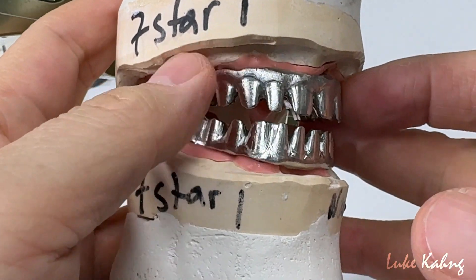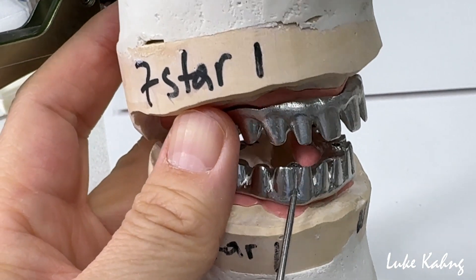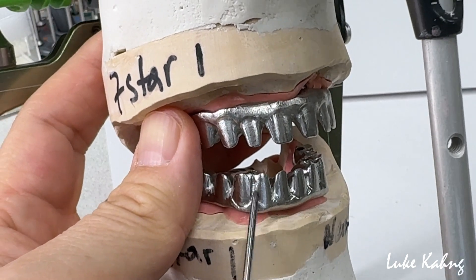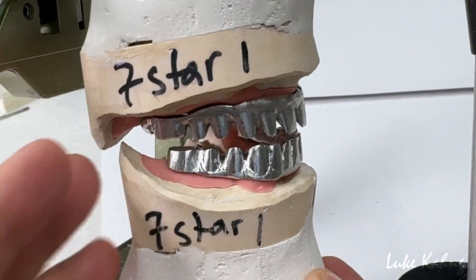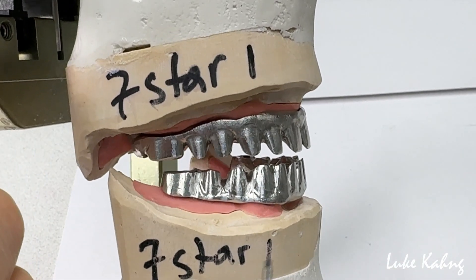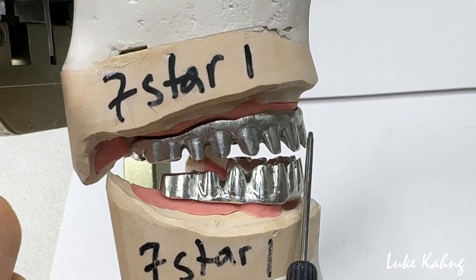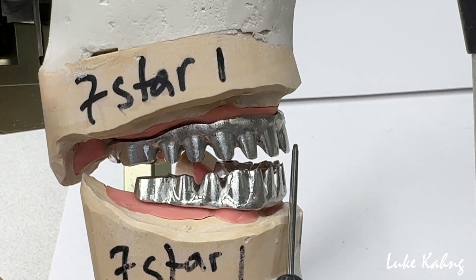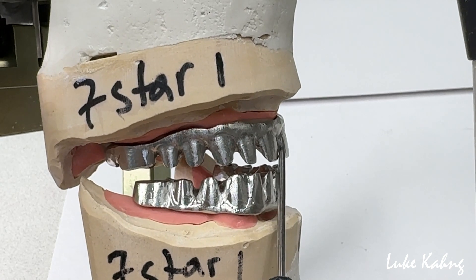Maybe I need a little bit more room. I noticed there's not much room in implant placement, so I'm trying to find a little bit more here. Facial contour is pretty good. Most of the time I'm concerned about the sticking-out position. Cobalt-chrome metal ceramics will be a little more sensitive about the color, so I trim a little bit more here.